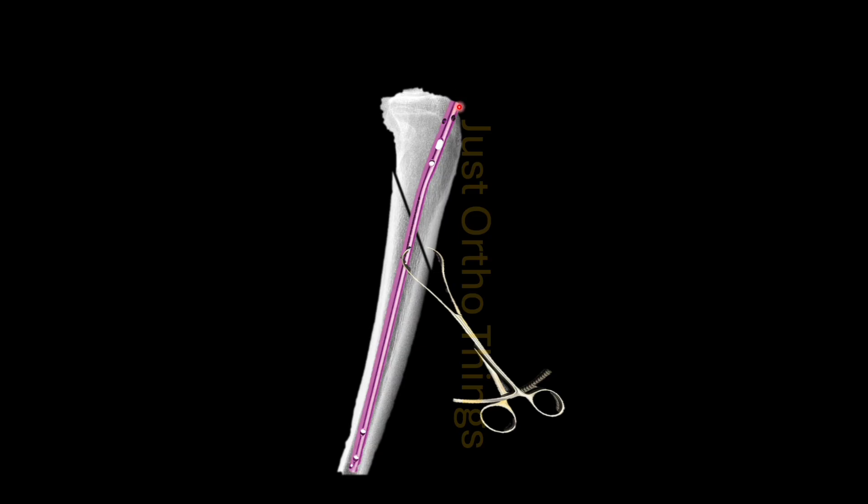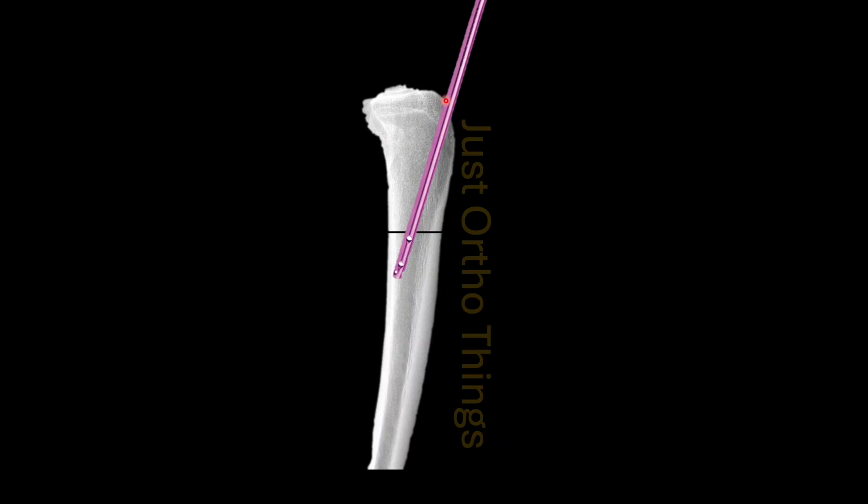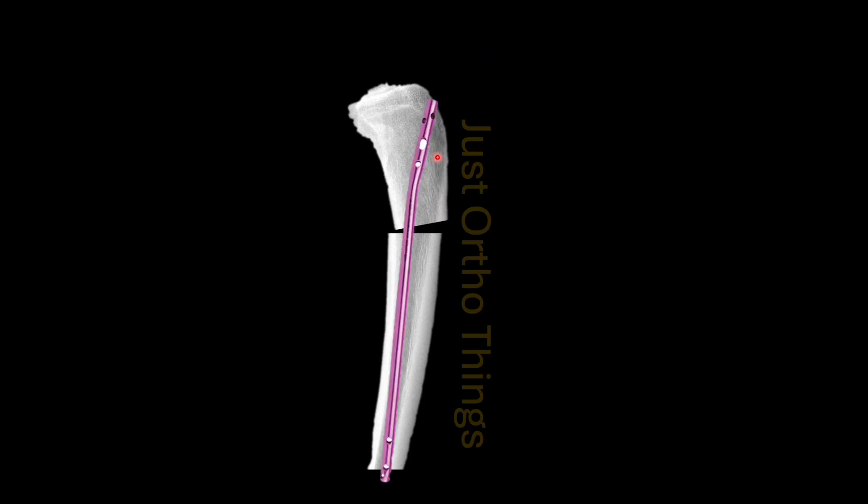Otherwise you'll tend to go through the anterior track, which will tend to deform your reduction once the nail has been completely inserted. The same thing applies for transverse fractures — when you insert the nail there will be anterior opening if you go through the anterior and inferior entry point. The desired trajectory is the area which is a bit posterior, meaning at the anteriormost extent of the joint line. Sometimes the fractures are so unstable that even after a good entry point the fracture tends to open up entirely.